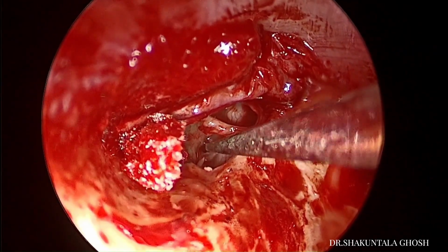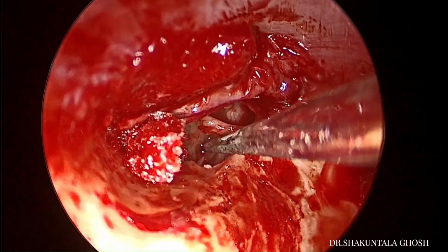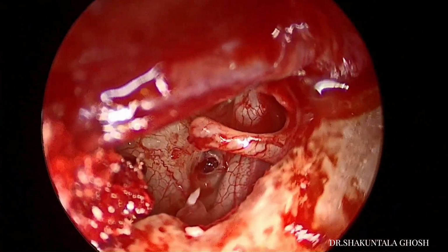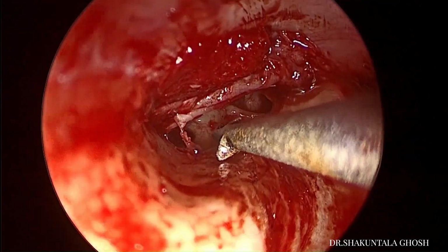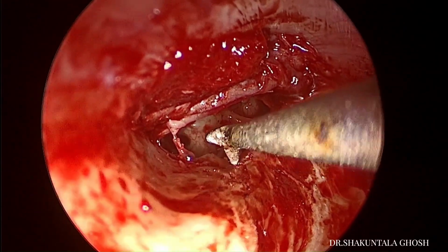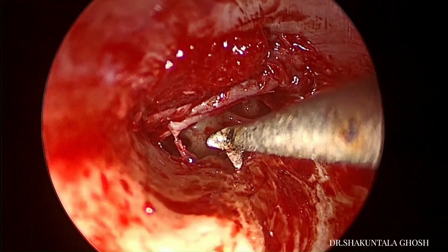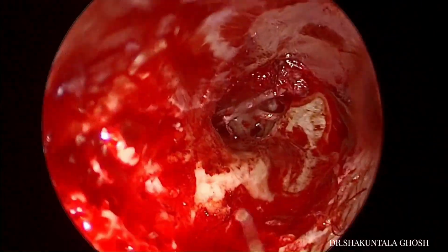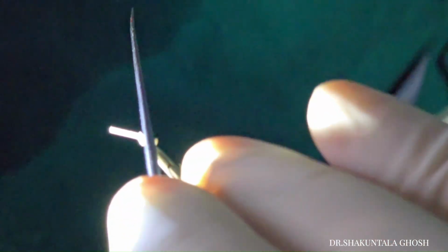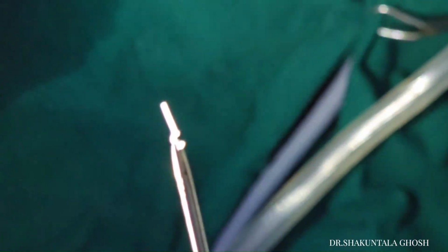So next, using the burr, I am widening the foot plate, the fenestrum, again very gently. So this is good enough. Now I am taking the measuring rod and trying to assess the length of the piston that I will require. One must take 0.25 mm extra so that that part lies medial to the foot plate.